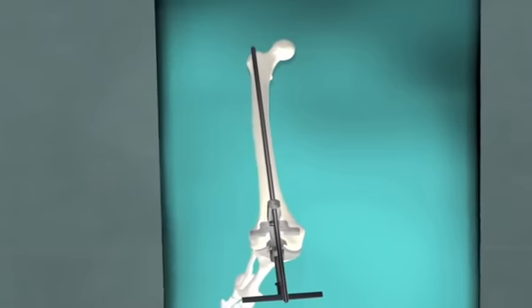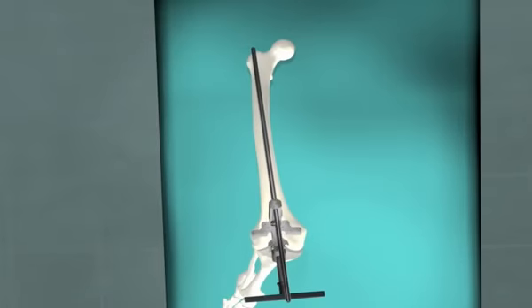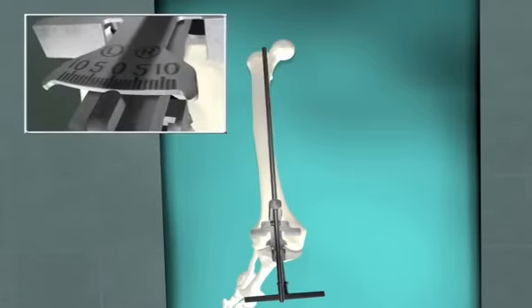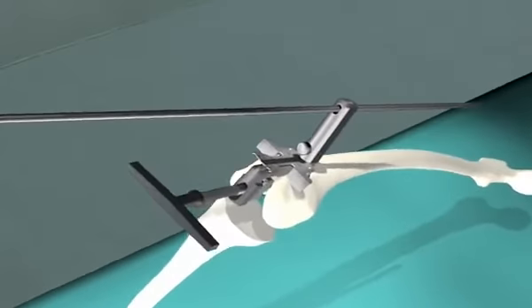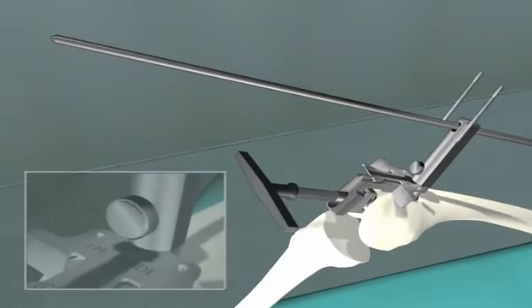This alignment position can be arbitrary and can be used with the anterior superior iliac spine using 1 to 2 finger breadths medial to this anatomic landmark to give this orientation. Alternatively, the guide can be aligned at 3 degrees, 4 degrees, or 5 degrees, depending upon the patient's height. The guide is drilled and pinned.